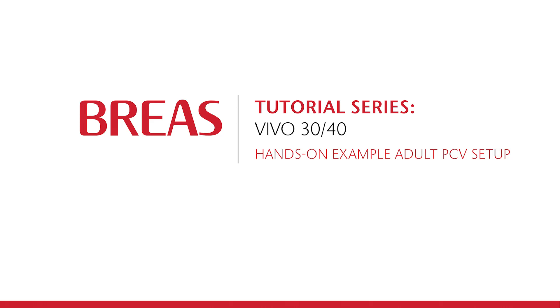Hello and welcome to the Bria's tutorial series. In this video we will show you how easy it is to do the setup of the Vivo40 ventilator so that it can be used to supply pressure controlled ventilation for an adult patient.